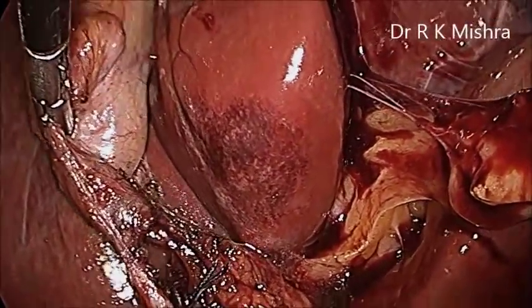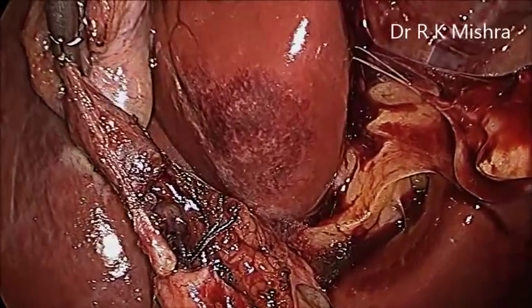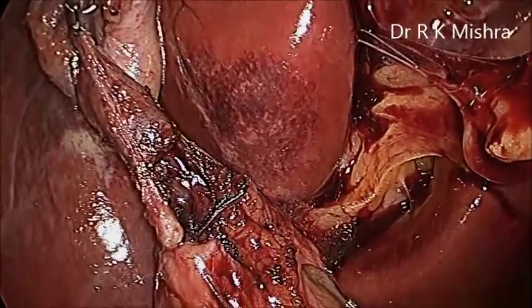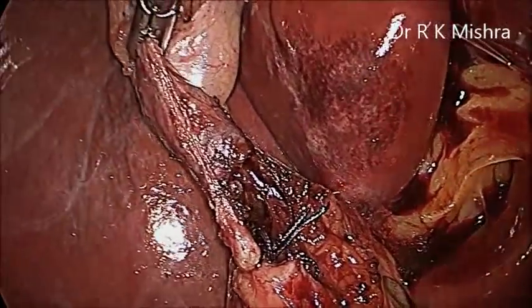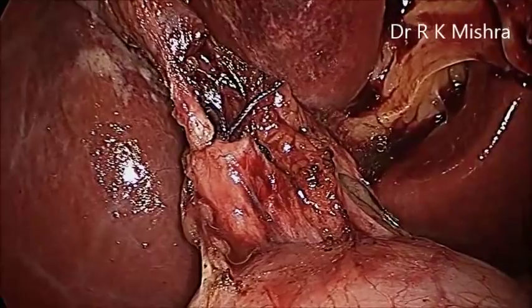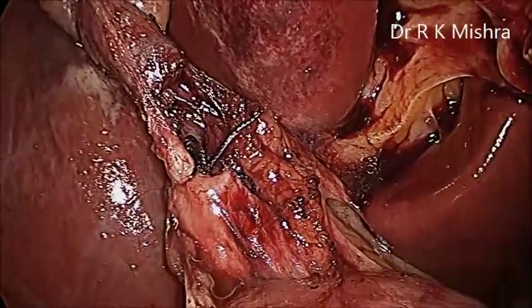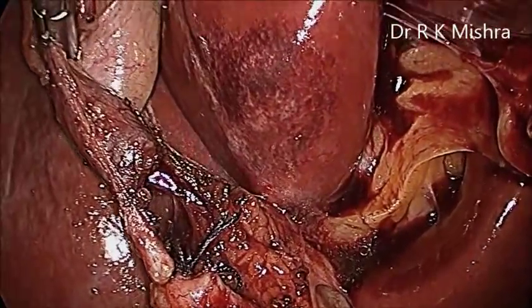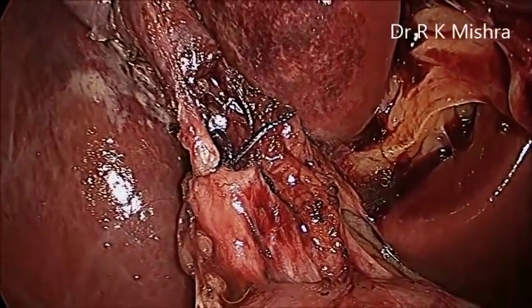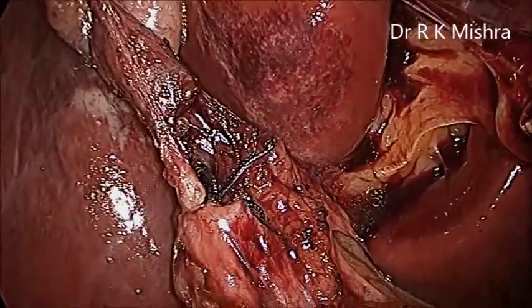Now we will cut the cystic duct with the harmonic. The idea is that if you use the harmonic, you don't have to tie another knot or another clip, because it will seal and there will be no leaking of the cystic duct most of the time. If it leaks, you can apply the clip or you can catch the portion where it is leaking by the left hand grasper. So now this is the harmonic coming.